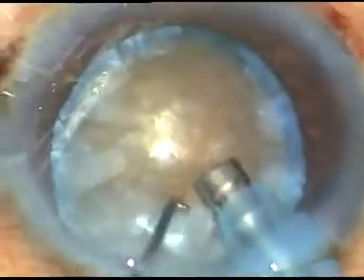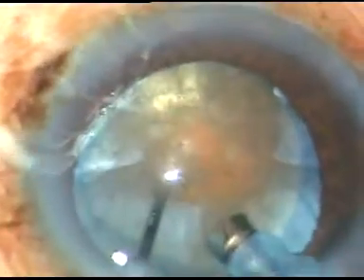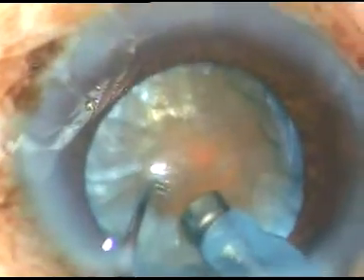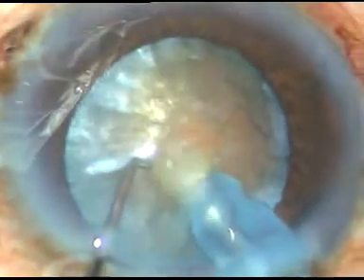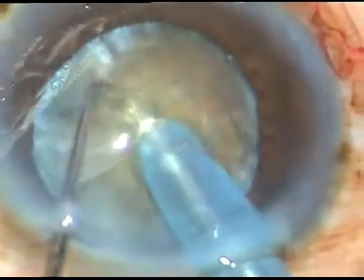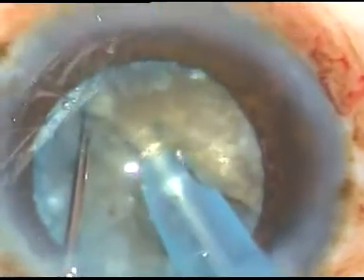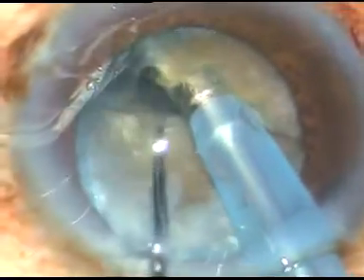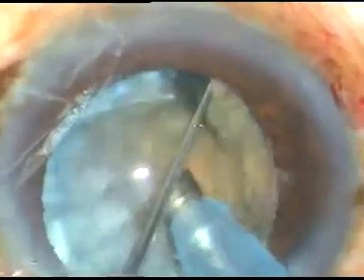And see the submarine chop. The phaco tip goes into the substance of the nucleus, travels through the nucleus as a submarine goes through the water, goes to the opposite equator, and the chopper is then used to chop the nucleus. Now this crack has not gone to the opposite side.